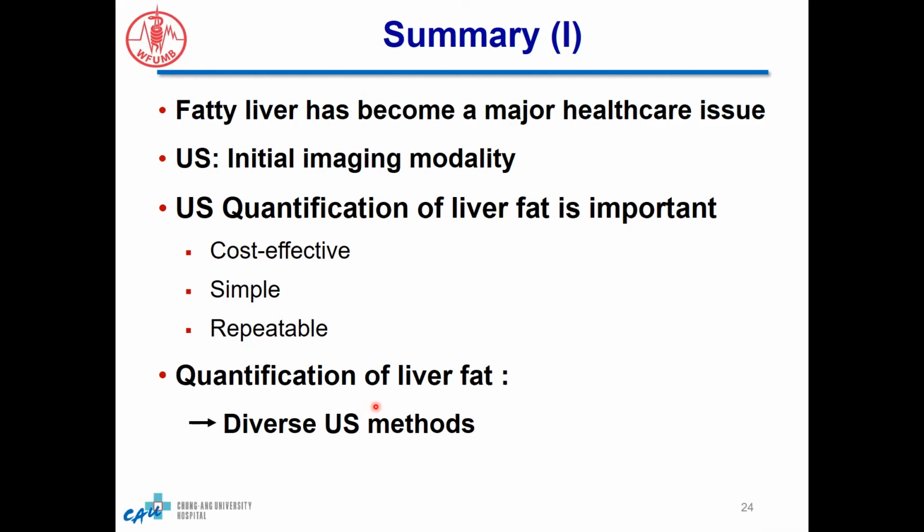Let me summarize my presentation. Hepatic steatosis has become a major healthcare issue worldwide. Ultrasound is an initial imaging modality. Ultrasound quantification of liver fat is important because it is cost-effective, simple, and repeatable. Currently, we have diverse methods for quantification of liver fat.